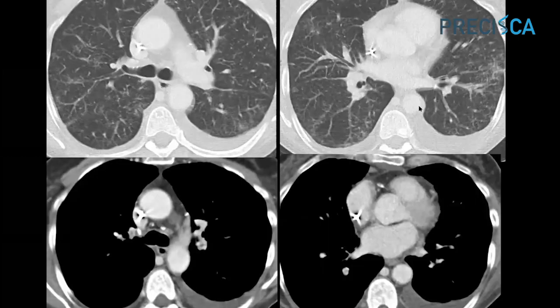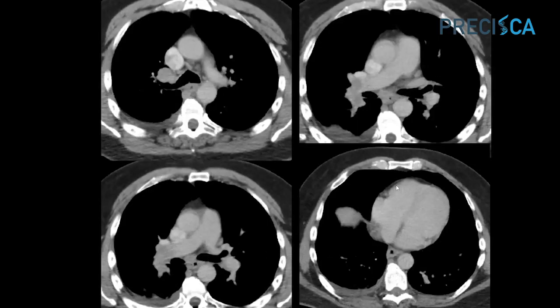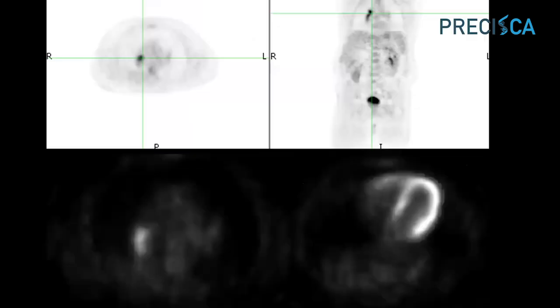Now, occasionally there will be microscopic tumor emboli to the lungs. Those will be picked up, as in this case, with branching structures that are best seen on our lung windows, as we see here. And occasionally you may see other findings of metastatic disease, including malignant pleural effusion or lymphadenopathy, but those aren't required. These patients tend to be very profoundly symptomatic. And finally, if you have a filling defect that you're concerned could represent tumor embolic disease, a reminder that this is a great time for consideration of FDG PET, which may show uptake in tumor embolic disease, or MRI, which can show contrast enhancement in that embolism, which would be very typical of a tumor embolism.